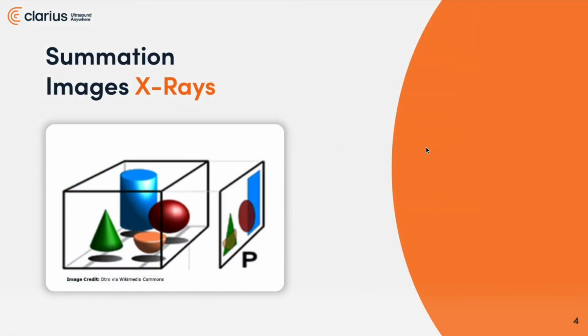In summation imaging, as you can see on this orange framed representation at the letter P, the image from X-rays are of the items in this room summed together or placed on top of each other. I like to think of it simply as if there were a sofa in that room and your friend was hiding behind that sofa, you would see your friend hiding through the sofa, and you would see various items summed together in the picture.